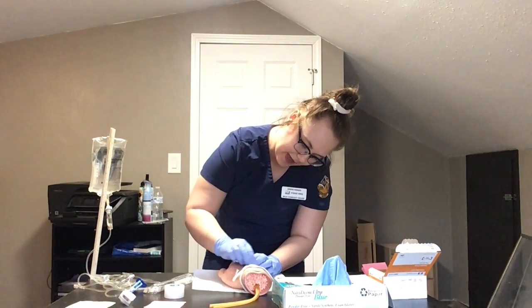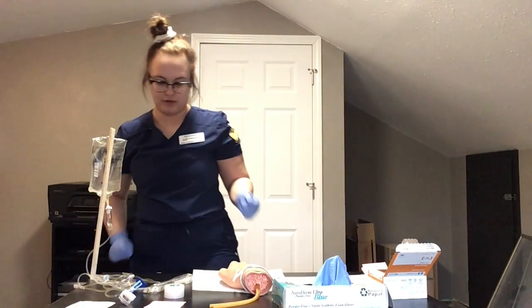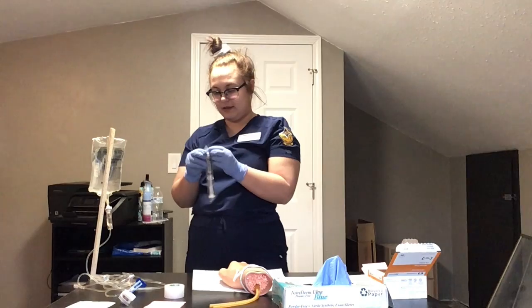Then I'm going to let that dry, and I won't blow on it or wipe it down or anything like that. And while I'm waiting for it to dry, I'm going to get my saline wash ready.